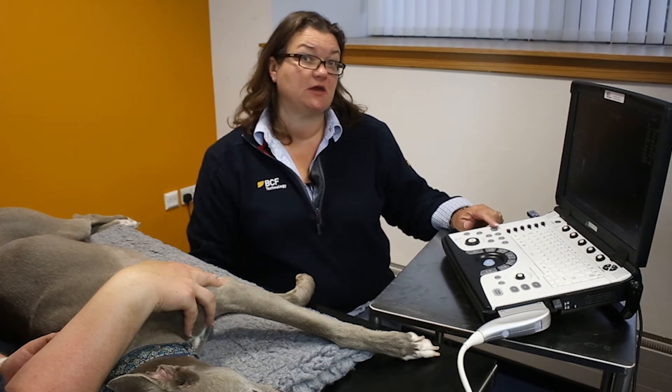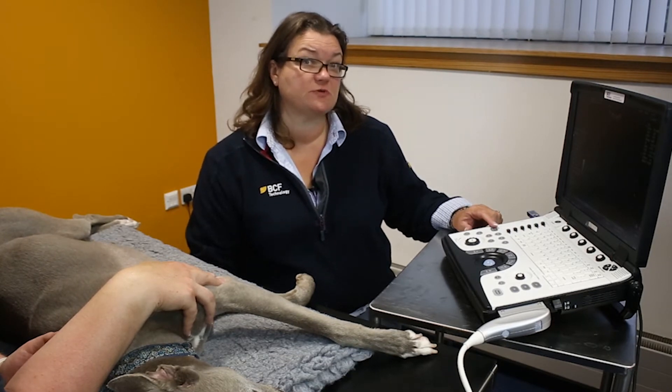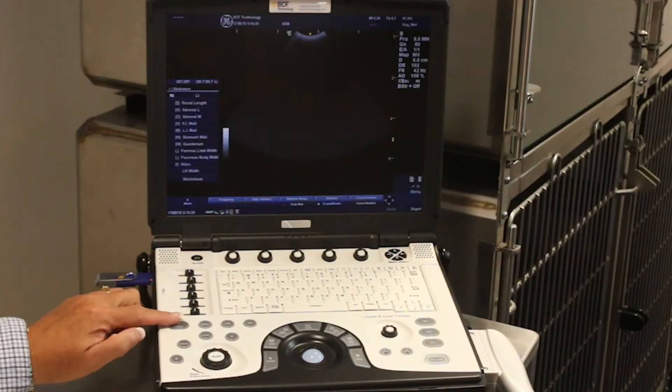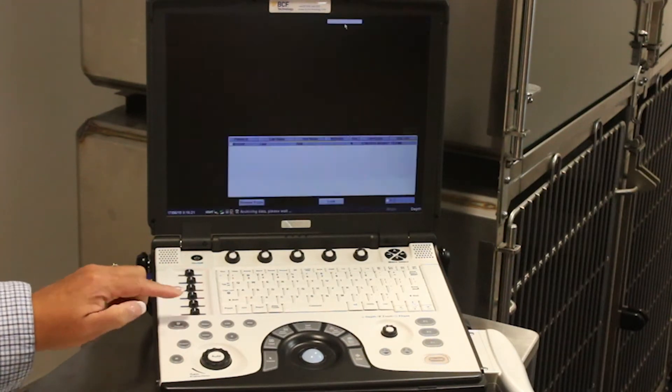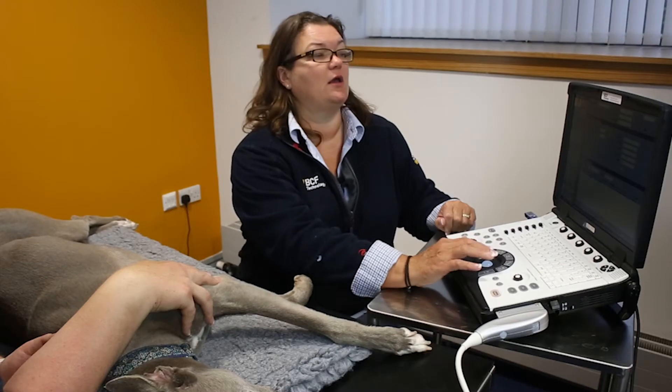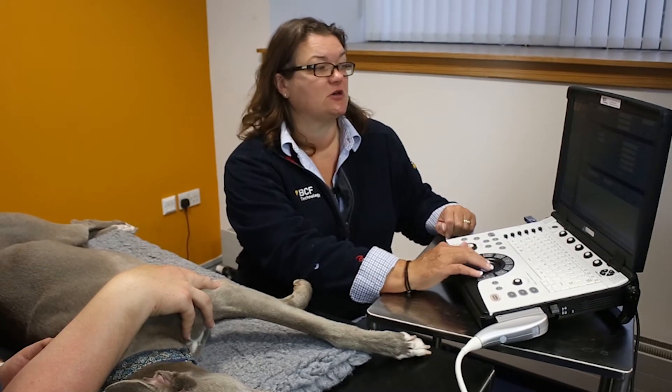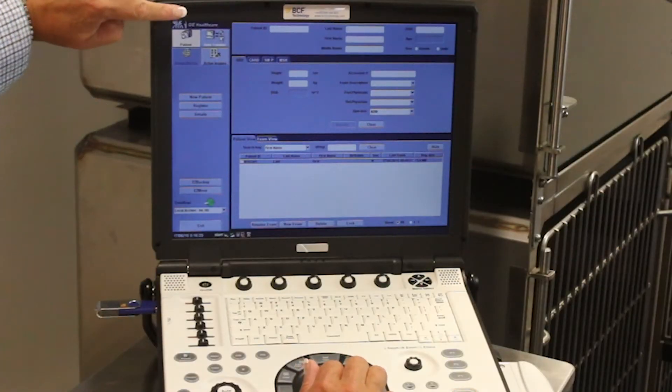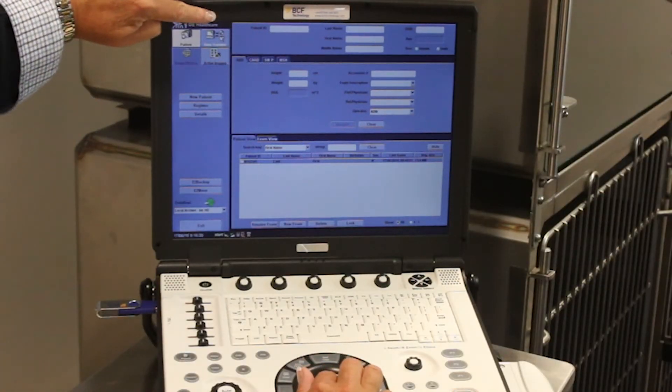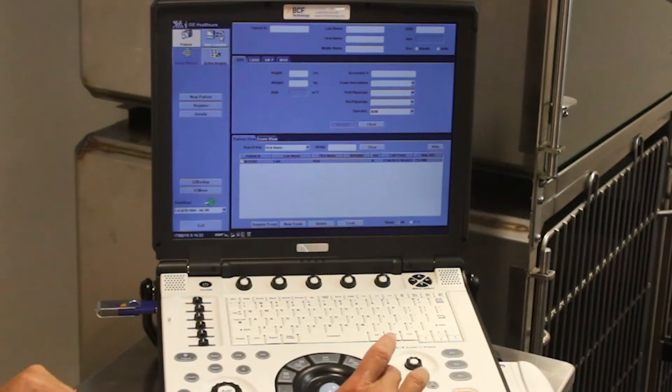Now I need to be in the patient demographic screen in order to be able to select the patient that I want. And I'm going to be wanting to go to the data transfer function, which is accessible on the top left-hand side of the patient demographic screen.